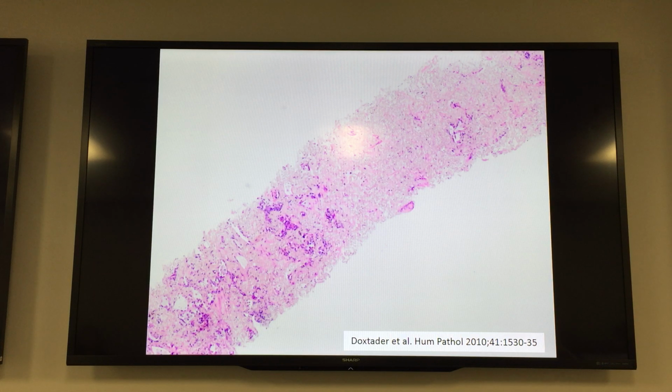And then, what is this one? Oh yeah. Anyone? Nothing malignant, right? What's the pathology? What is the vast majority of this nodule like here? Degenerated elastin fibers. Yes, that's right. It's like solar elastosis like you get in the skin.